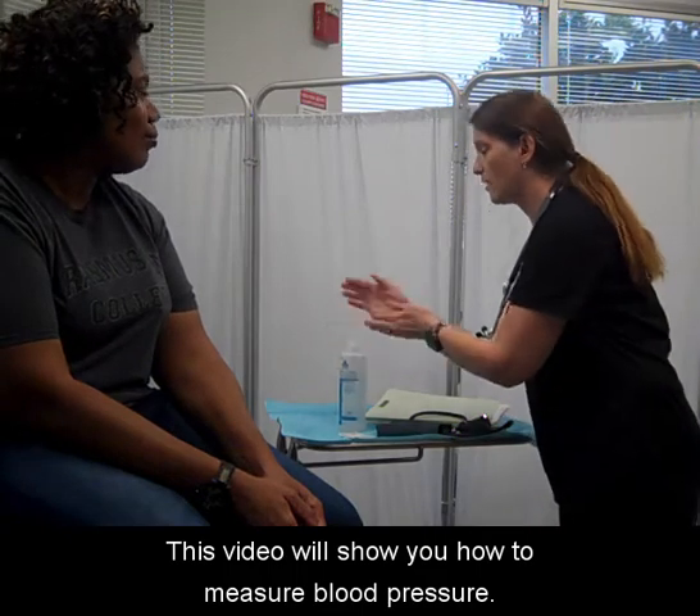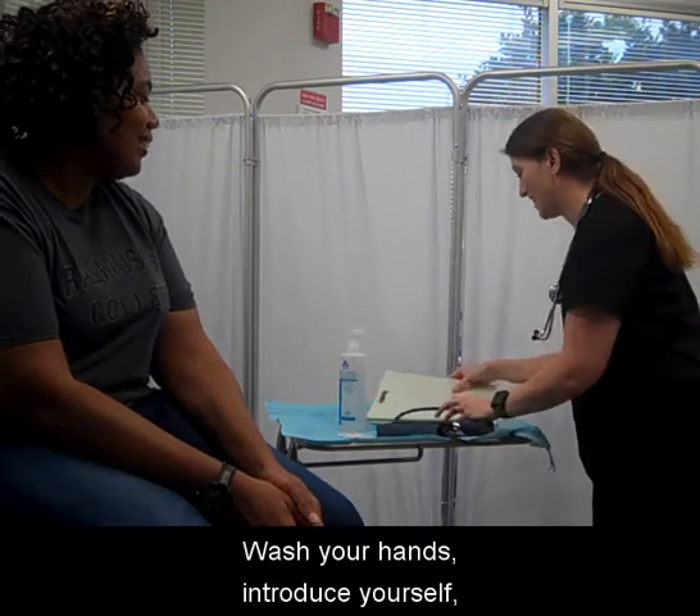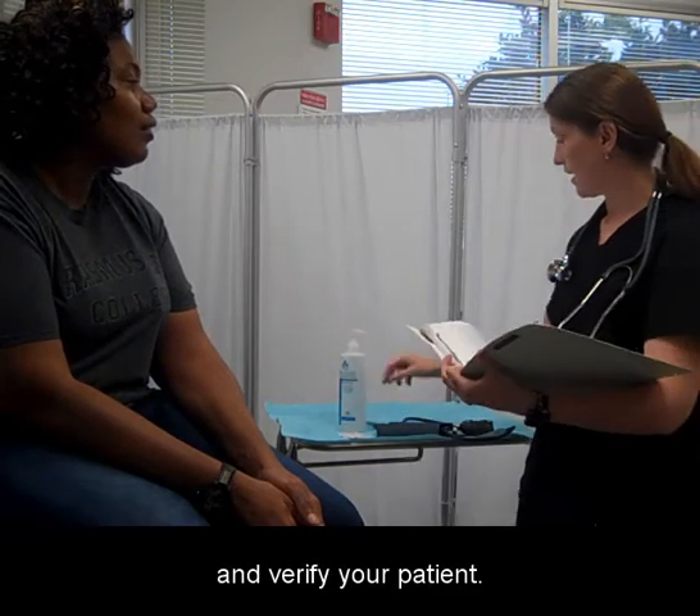This video will show you how to measure blood pressure. Wash your hands, introduce yourself, and verify your patient.